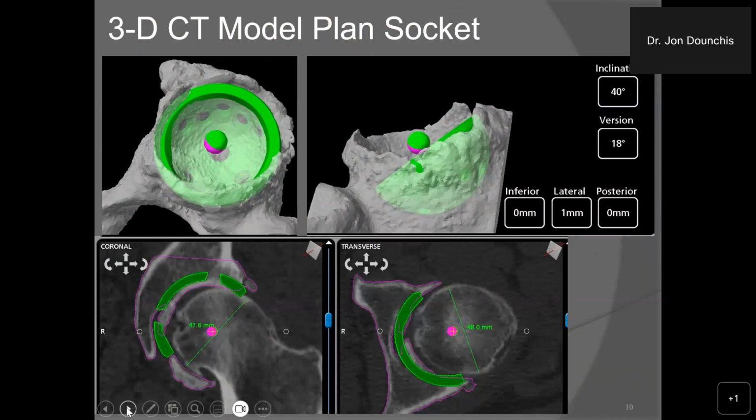And the 3D planning phase and then implementation with the robot allows us to accurately reconstruct the hip center of rotation in 6 degrees of freedom. You can see from these slides here, all the extra bone extrinsic to the green surface area here. That's all extra osteophytic bone or non-normal bone that's formed over time in response to the arthritic process. And this type of technology can really enable clearly delineating the proper mechanical goals for this joint reconstruction and achieving those goals as will be depicted. Next.